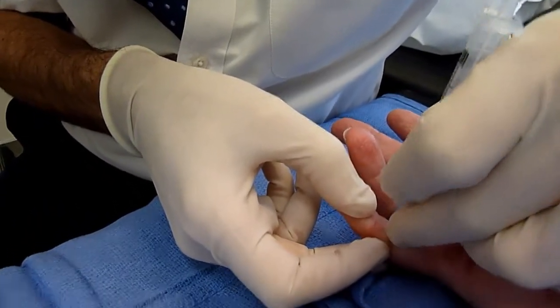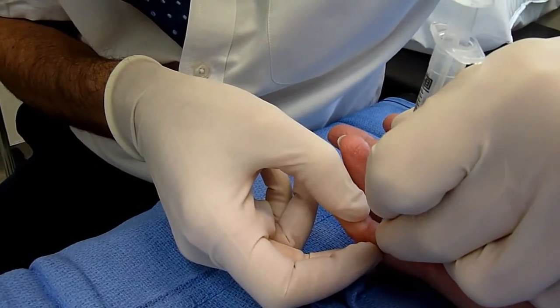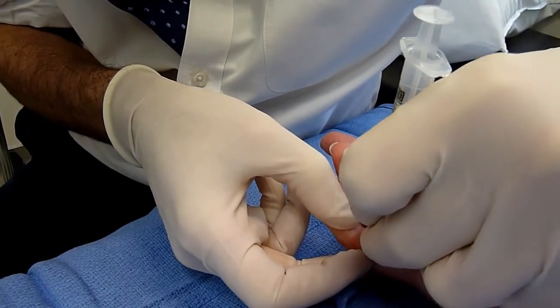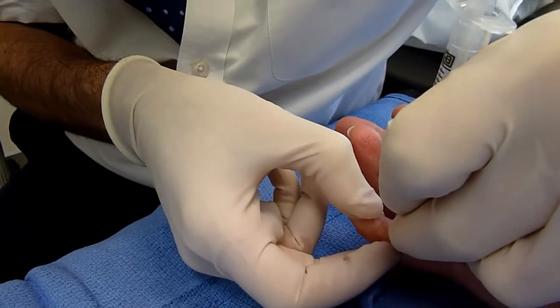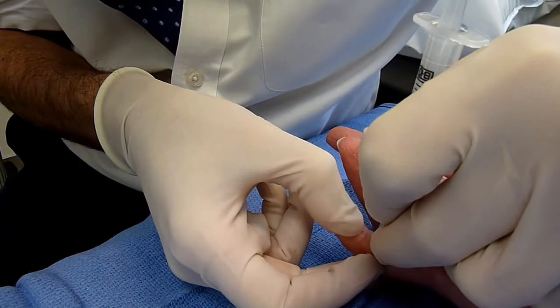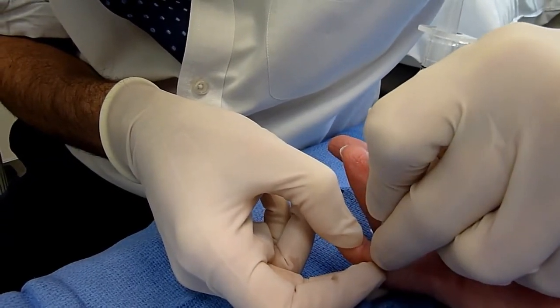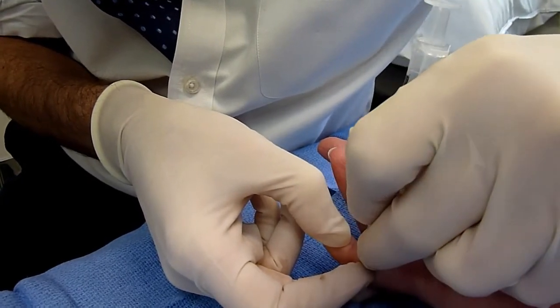So the biggest difference I noticed in technique is I just numb the very surface of the skin, and then I do my work in a way that you will still feel what I'm doing. Oh, I like what you're doing. The difference is he actually started in the palm and injected deeply on both sides of the tendon in a way that is totally going to then numb your nerves. Okay. So the problem is you lose that protective feeling. Exactly. Yeah.